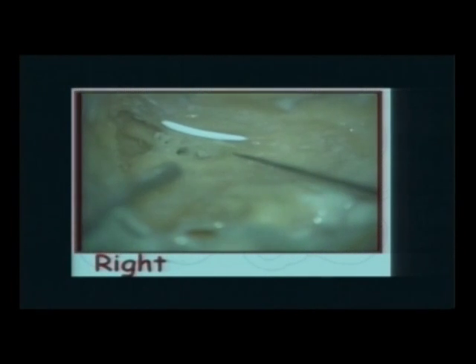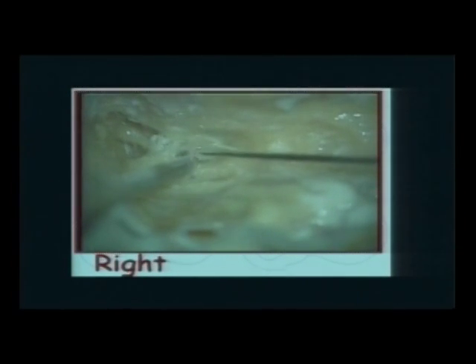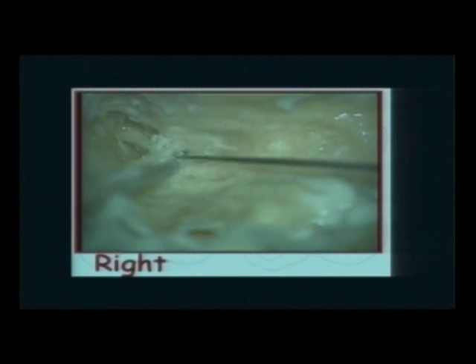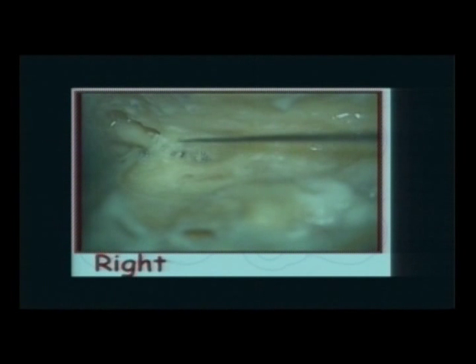Drill onto the facial nerve. You see the air cells here? These are sentinel air cells. This is the chorda tympani. And in the back here, this is the mastoid segment of the facial nerve. And the air cells there, these are what? The sentinel air cells. Very nice surgery. You're working on bone, so you shouldn't be afraid. Gently, good irrigation, and keeping this incus buttress. You see the short process, when you take a line like that, points to the facial nerve.